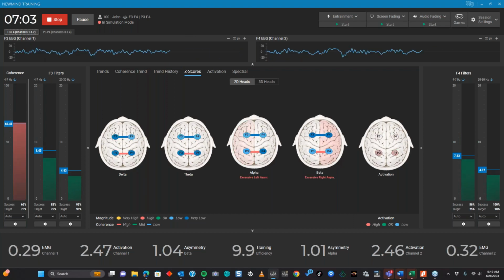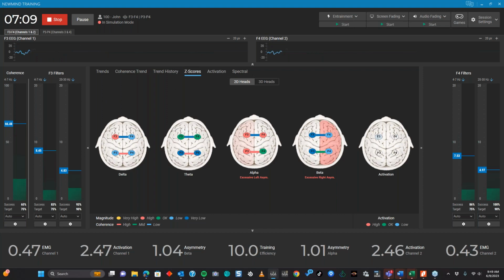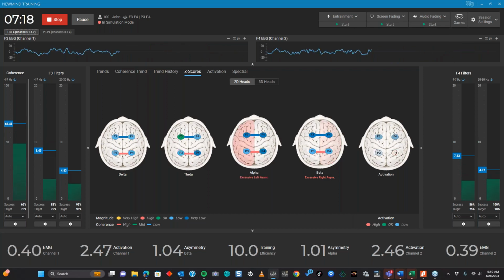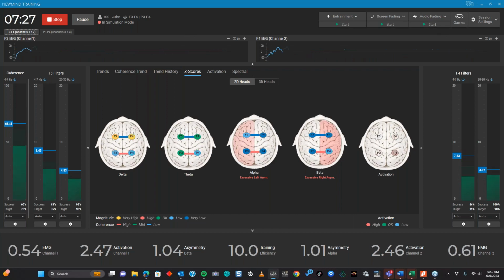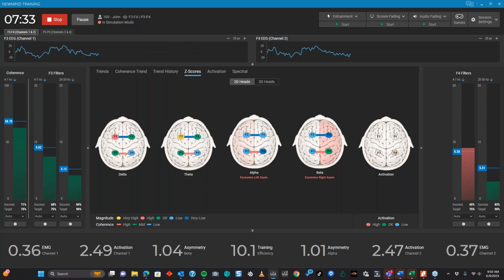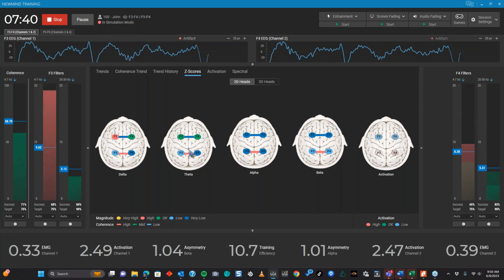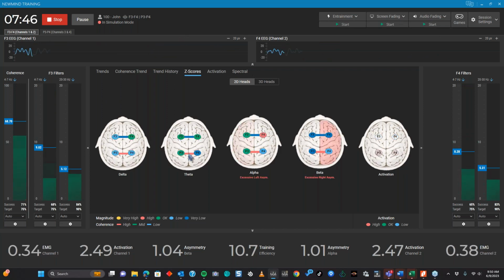And Dr. Suter brought this up in his video discussing this protocol. It was recorded about 3 years ago. And the one thing that he mentioned was how rapidly coherence changes and moves around comparatively to the amplitude of our signals. So coherence is going to be rapidly changing. That's what we've seen here. If you guys have been watching these lines, P3, P4 has been going from hyper to hypo, back to hyper, back to hypo. So we are seeing a lot of rapid changes.